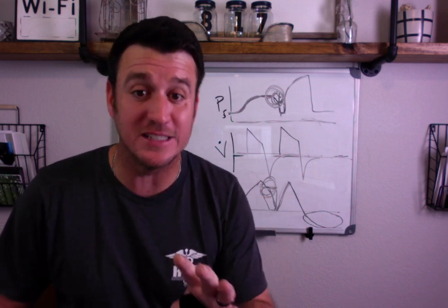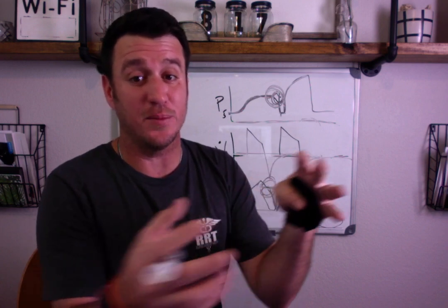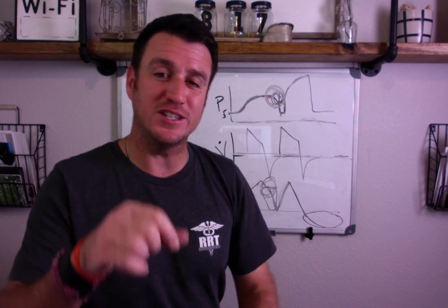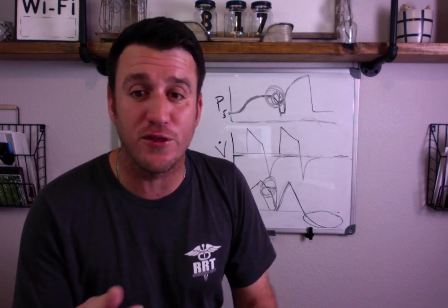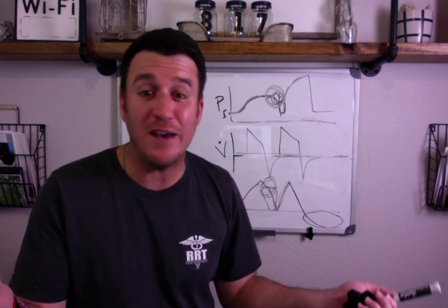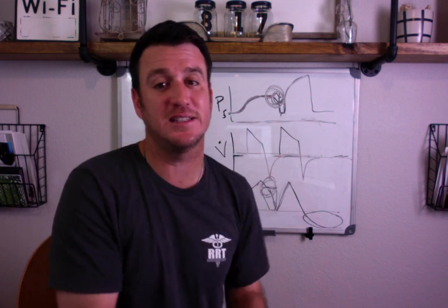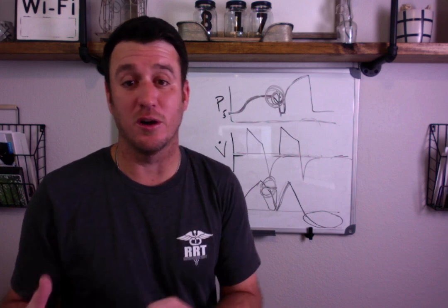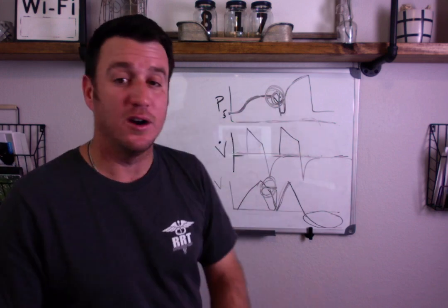Now what they're going to get is another 400 mLs. So we're essentially giving now a tidal volume of 800 mLs. Where if we just tweak the tidal volume a little bit, maybe all they want is 430 or 450. Maybe 470. Maybe they want 7 mLs instead of 6 mLs per kilo. And that's not going to harm your patient, as opposed to this happening all day long.